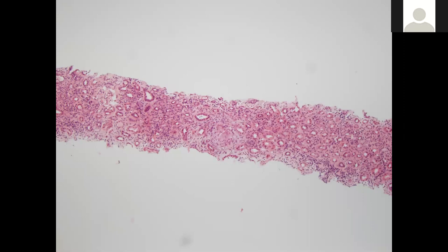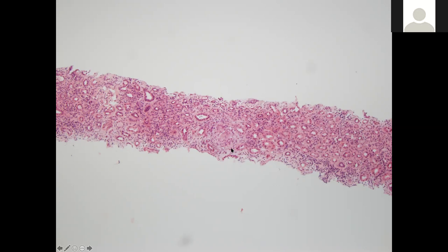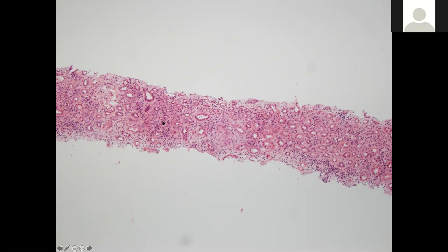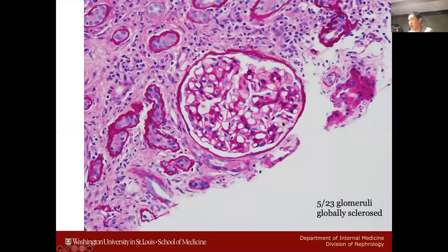This is low-power H&E. The tubules look fairly apart, and there does seem to be hypercellularity in the interstitium. There's only one glomerulus visible here — something that could be mistaken for a glomerulus is actually not. Even at this power, you can see all of this cellular infiltrate in the interstitium. That's not normal.